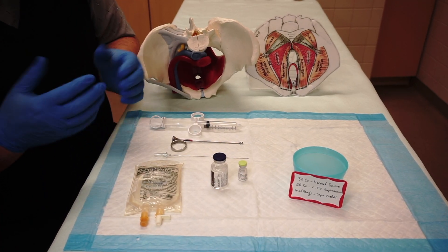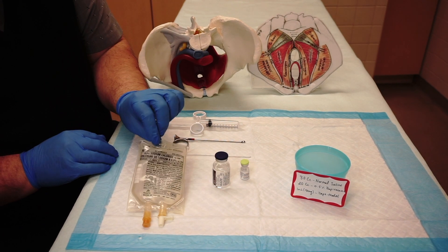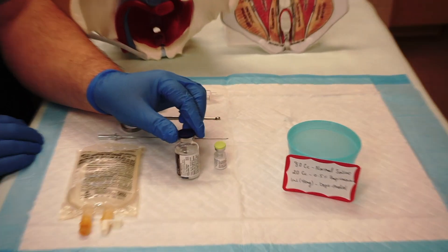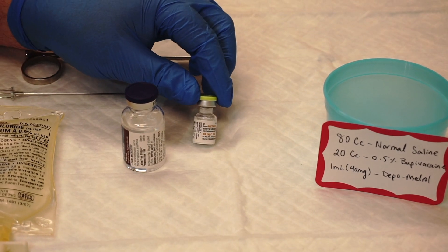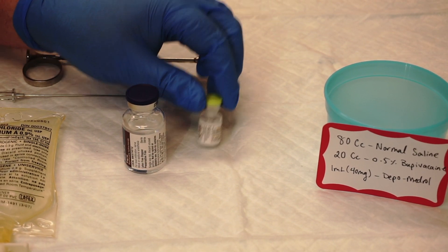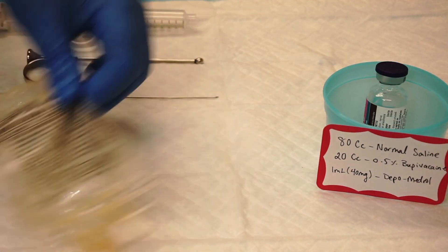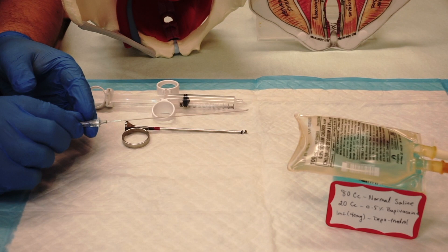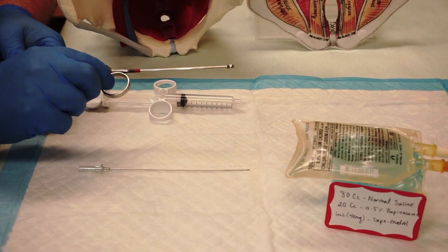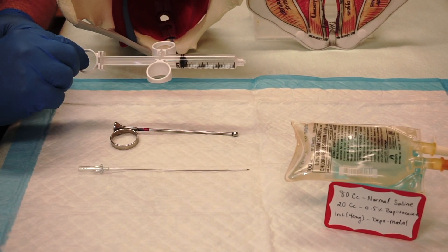For this procedure we require sterile gloves, 80 cc of normal saline, 20 cc of 0.5% bupivacaine, 1 cc or 40 milligrams of solumedrol, a 20 gauge long spinal needle, Iowa trumpet, and a 10 cc controlled syringe.